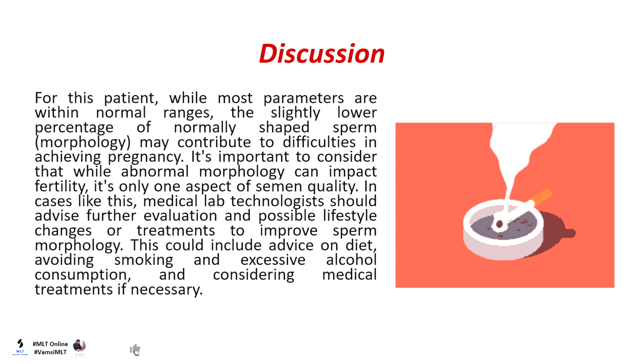Discussion. For this patient, while most parameters are within normal ranges, the slightly lower percentage of normally shaped sperm morphology may contribute to difficulties in achieving pregnancy. It's important to consider that while abnormal morphology can impact fertility, it's only one aspect of semen quality.